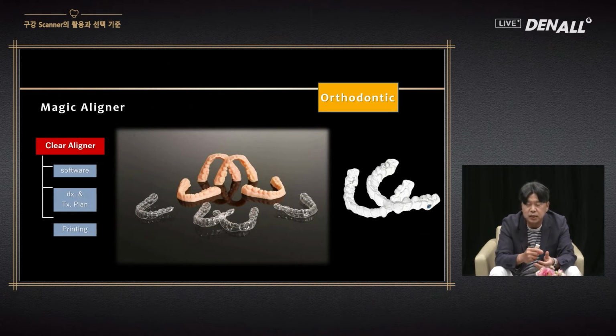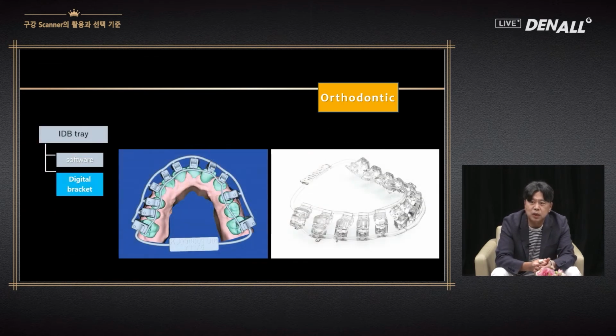Most importantly, a full arch scan should be captured appropriately. Years ago, the intraoral scanner was not very good for full arch scanning. At that time, the impression was taken with rubber and scanned through a model scanner. These steps were taken, but now IOS can be used.